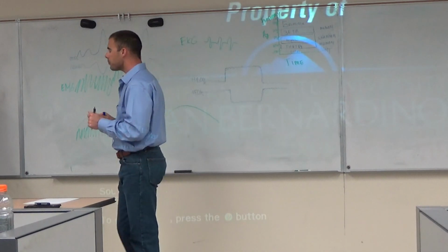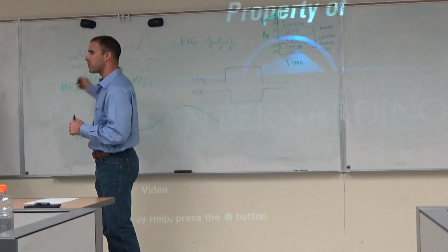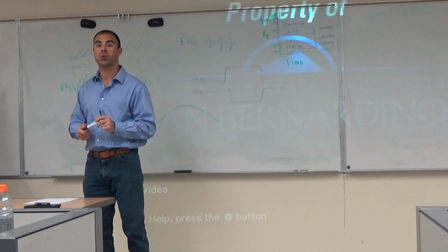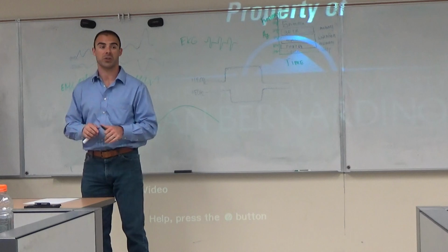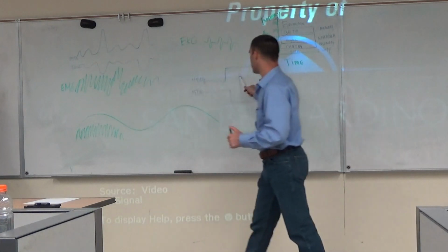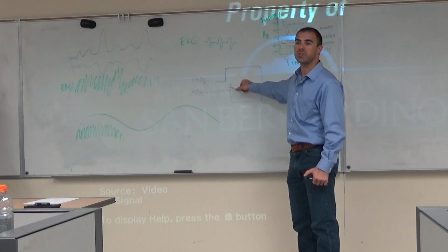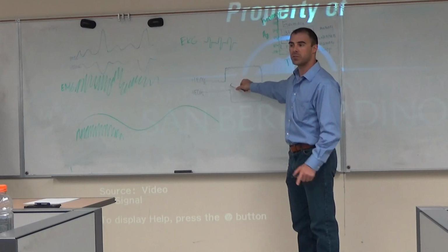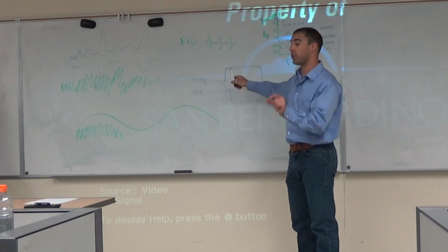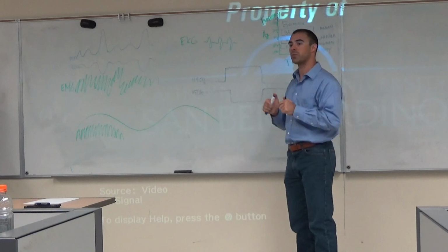The way that you could account for the eye blinks after the fact is to either reject the trials, you just say, nope, we're not including them, or two, we could correct the trials using something like ICA. So we'll talk about that a little bit more too. So let's move to the other eye activity. You can basically do the same, well, actually a little bit different preventatively, right? Yes, Kelsey, what could you do to account for it? Make the word small enough so that they don't have to shift their eyes back and forth. Yeah, you want to make the word smaller so that they don't have to shift their eyes back and forth.